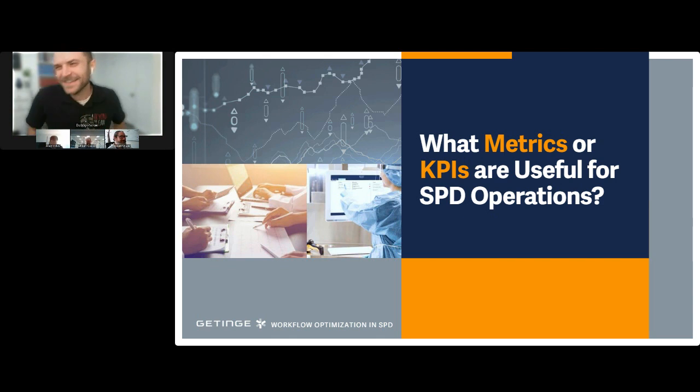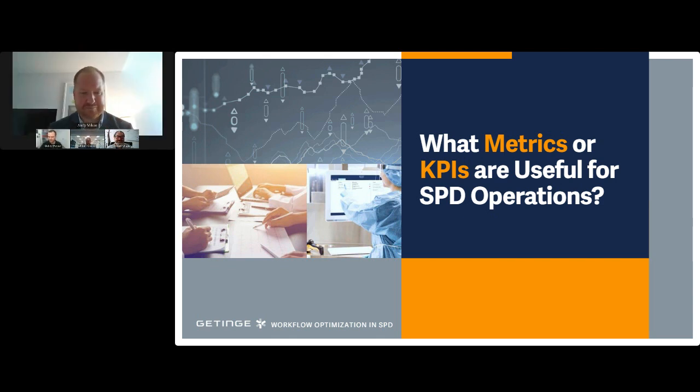So I will say data is extremely critical. You want to be able to measure a wide array of things, but one thing is, for example, I'll focus on the decon process. You want to make sure that whatever you are putting through your decon process truly is coming out clean.